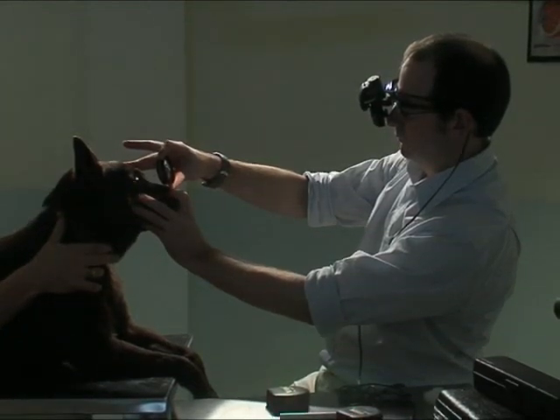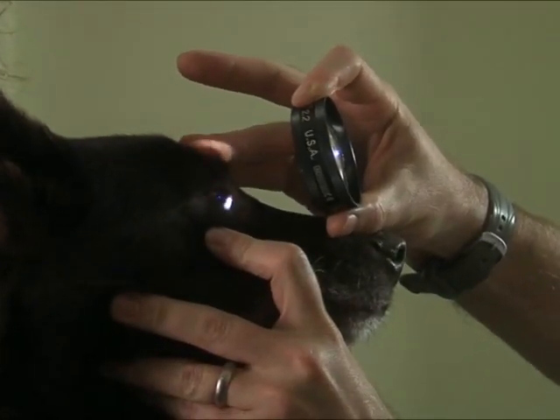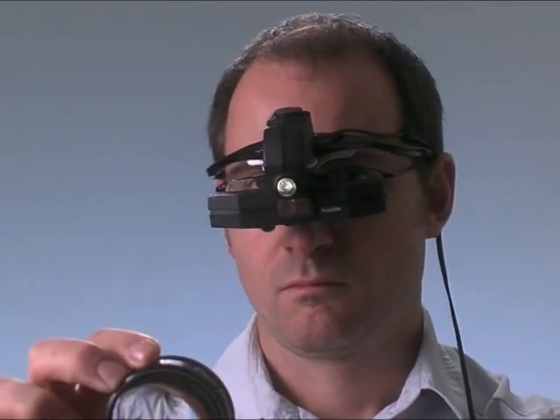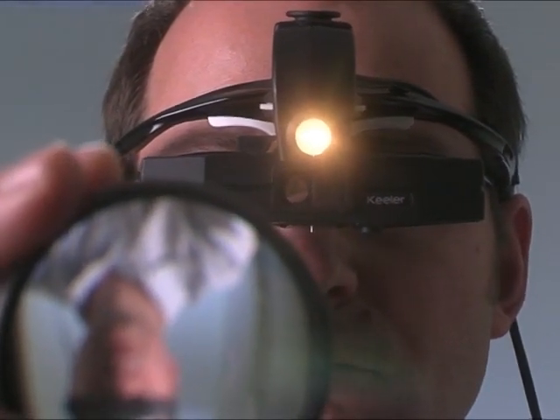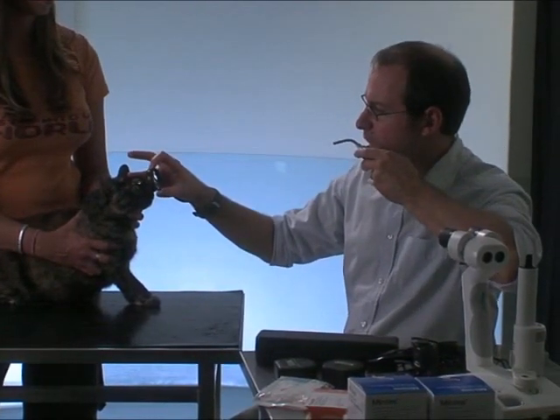The essential components for indirect ophthalmoscopy are a light source and a suitable lens. Binocular indirect ophthalmoscopes are expensive, but they provide stereopsis and therefore the added benefit of depth perception. A much cheaper alternative is to use a handheld light source. This method does not give stereopsis, but can still provide valuable information.